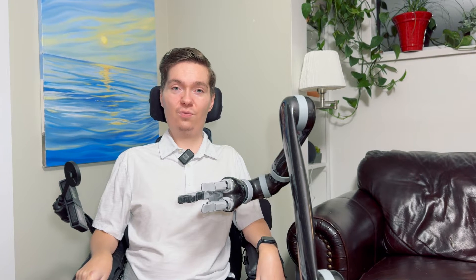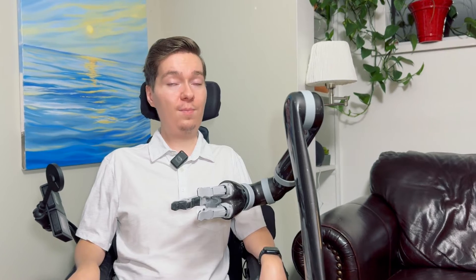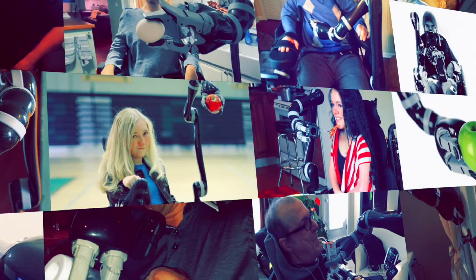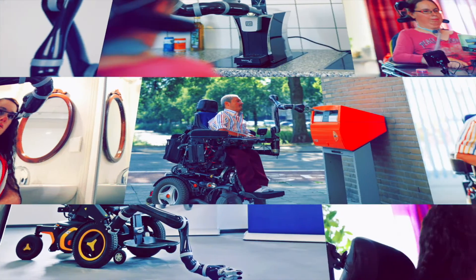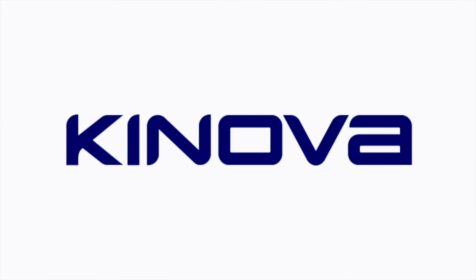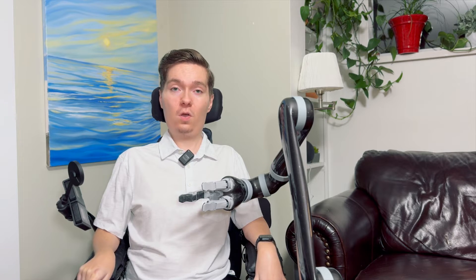Hi everyone, Taylor Danielson here from Kinova Robotics. Today I'm going to talk to you about the Jayco robotic arm and its lift arm accessory. The lift arm is an optional accessory that enables new utility for the Jayco robotic arm.